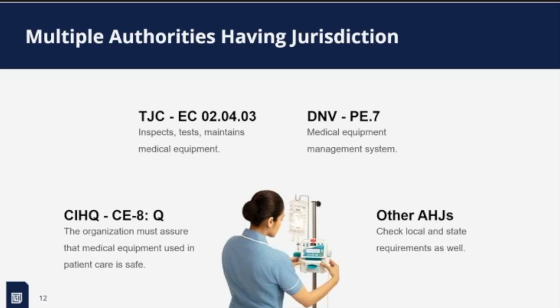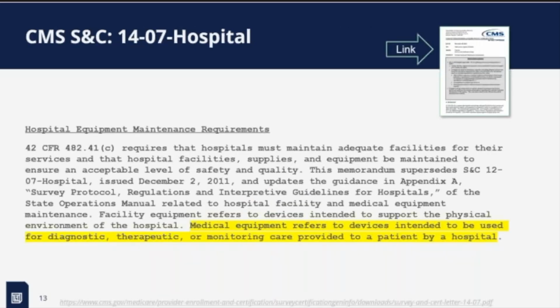And like I said, the two big ones are Joint Commission and DNV. We're going to start from CMS. They all start with CMS, the Centers for Medicare and Medicaid Services. Probably some of you may have never seen this logo before until recently in the news. I think this year there's a lot of eyes on CMS. It's making a lot more headlines on the news these days.